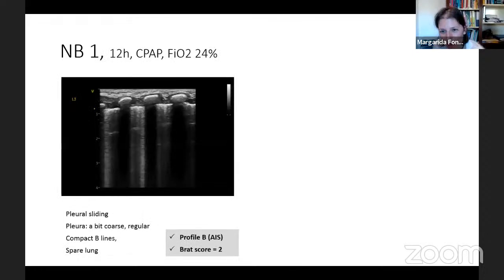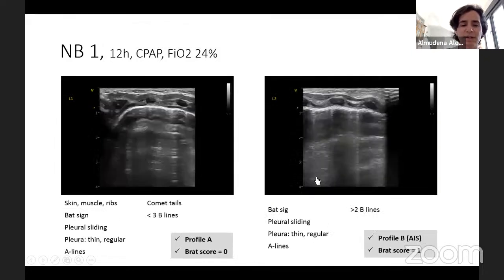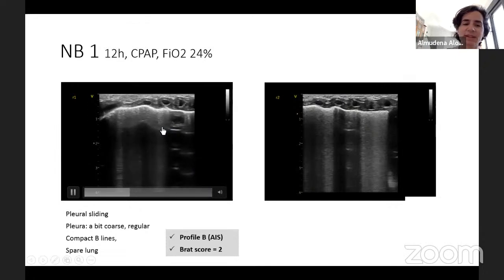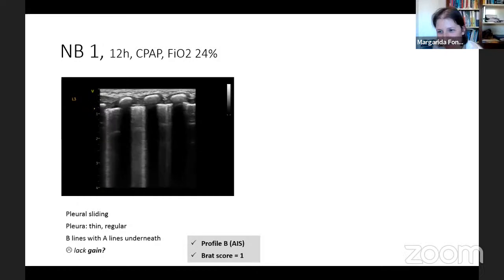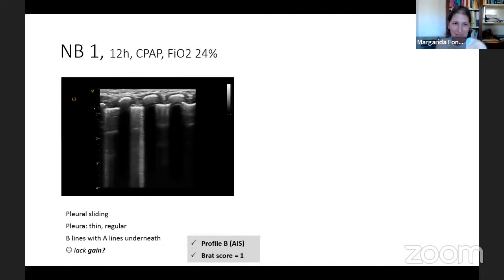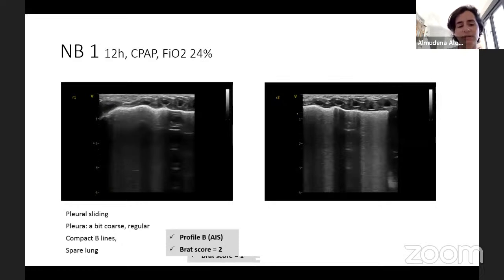The double lung point was here. You log it in the first one, this part here? No. These are quite good images. Here, this is maybe between this one and the previous one. I don't know if you had something in between. Yes, I had an L4 here, but I didn't include it because it was too many images. I'm not used to the order in which you show the images, but maybe this would be lateral. Yes, it's lateral. Maybe between this lateral and the posterior fields you would see the double lung point more clearly. Okay, because in the posterior ones that you show in the next slide, you almost have a complete white lung there. Okay. So that's what I have to show.